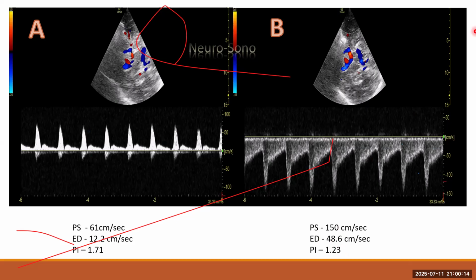A lesion at the ipsilateral MCA. Okay, fine. It could be that the patient had a malignant MCA infarct and underwent decompression, as already given in the scenario.